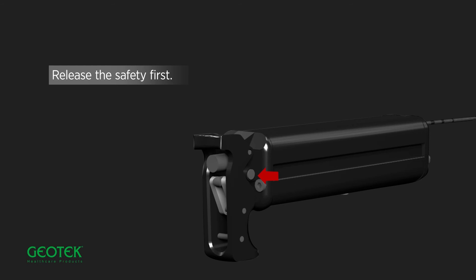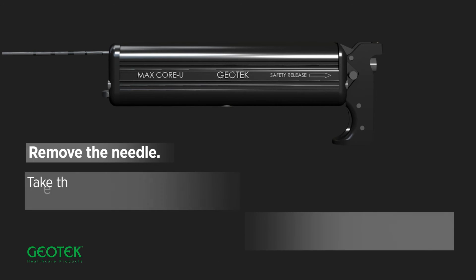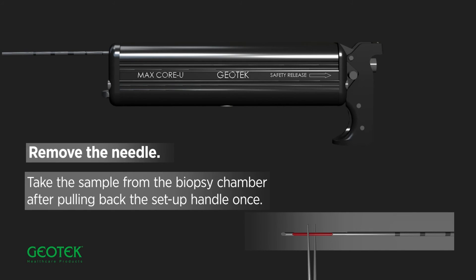Release the safety first. Remove the needle. Take the sample from the biopsy chamber after pulling back the setup handle once.